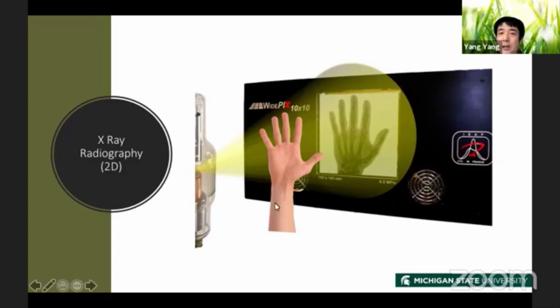For example, for the soft tissue and skin, the X-ray can easily penetrate them because they are less dense. But for those dense parts like the bones, it is much harder for the X-ray to get through. And therefore, if you look at the image of this X-ray, there are light parts which indicate the soft tissue. It has a large accumulation of X-rays. And there is also the dark part, which corresponds to the bones, because there is less X-ray that goes through from the bones.